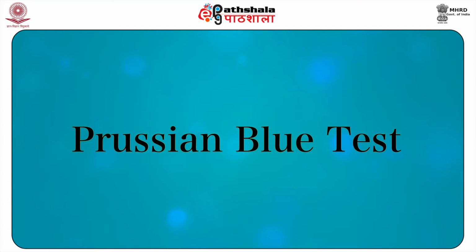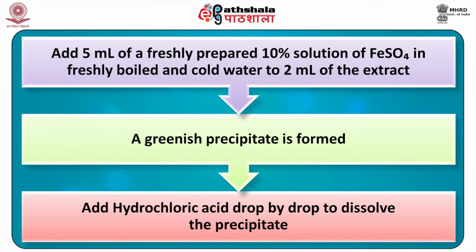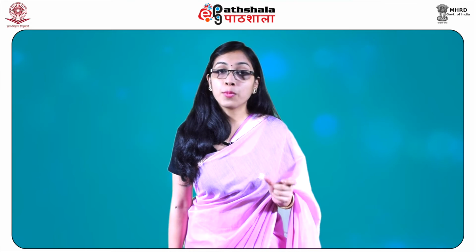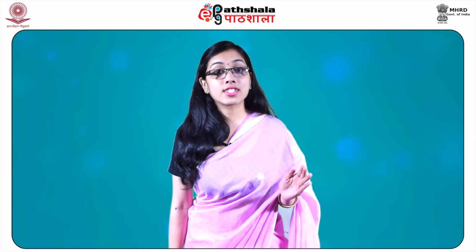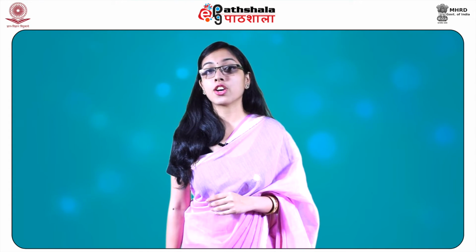Fifth test is the Prussian blue test. In this test, 5 ml of a freshly prepared 10% solution of ferrous sulphate in freshly boiled and cooled water is added to 2 ml of the extract. A greenish precipitate is formed. Hydrochloric acid is added dropwise to dissolve the precipitate. A blue coloration or precipitate, sometimes formed on keeping, indicates the presence of cyanide.